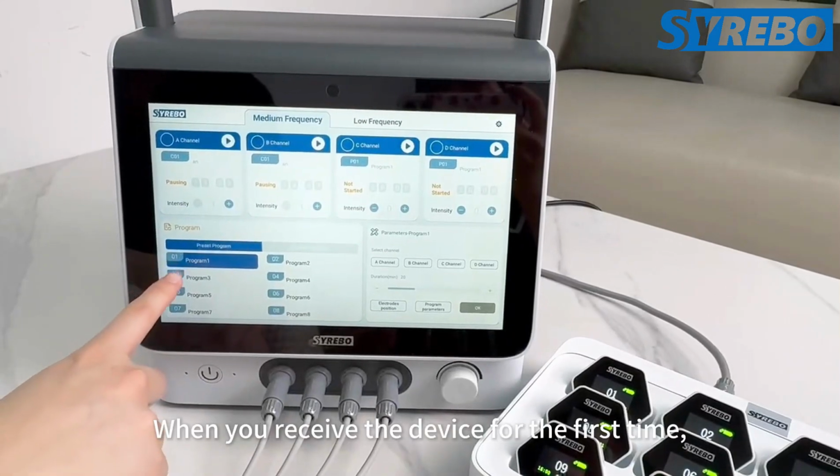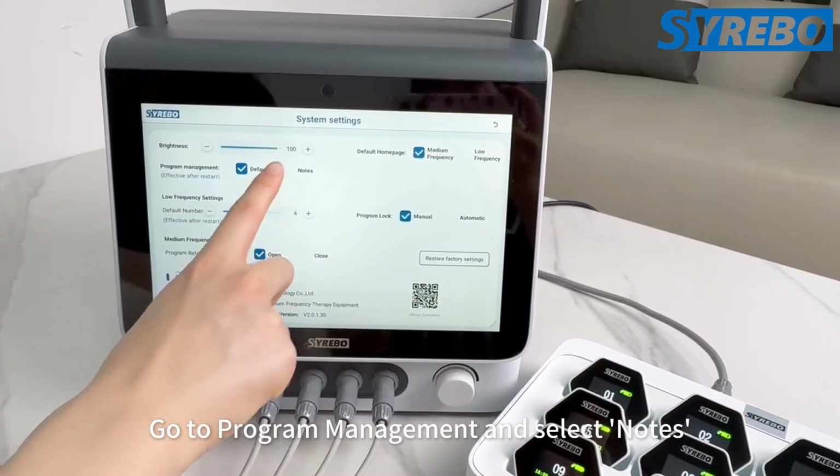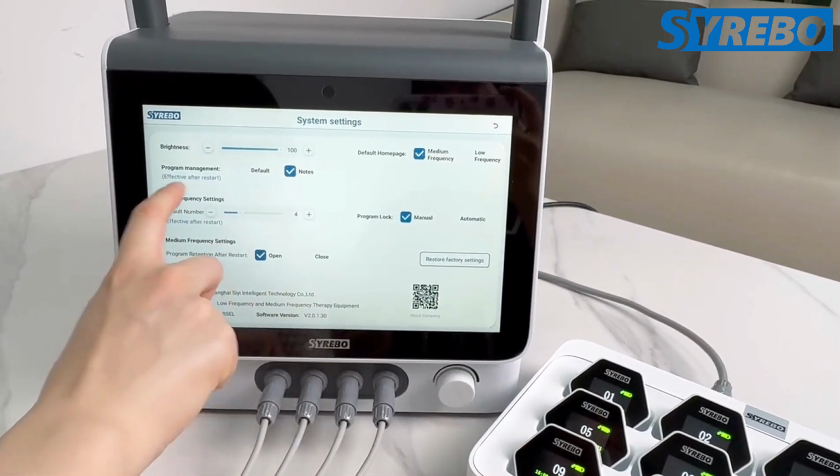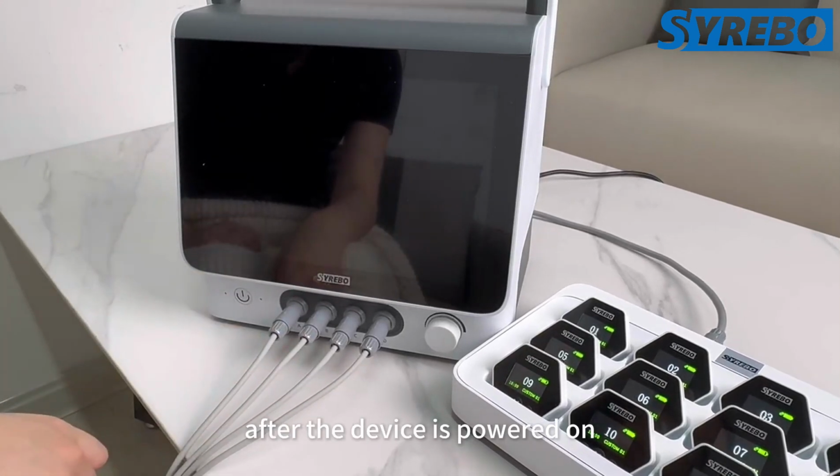When you receive the device for the first time, the program name may not be displayed. Go to Program Management and select Notes. Restart the device. The program name will be displayed after the device is powered on.